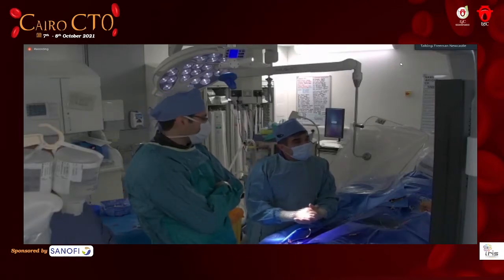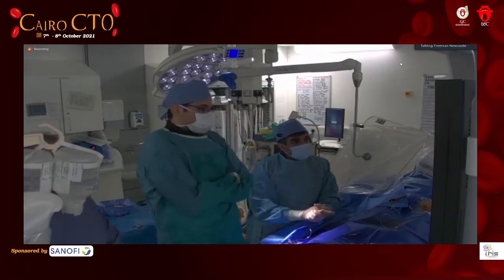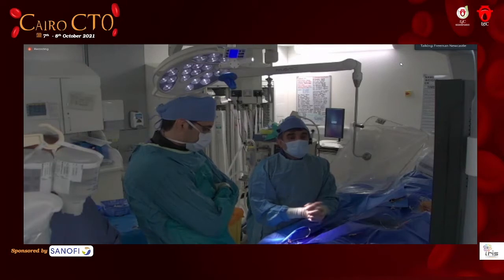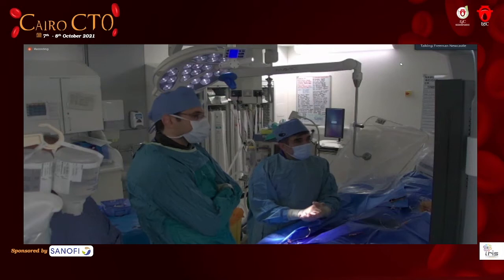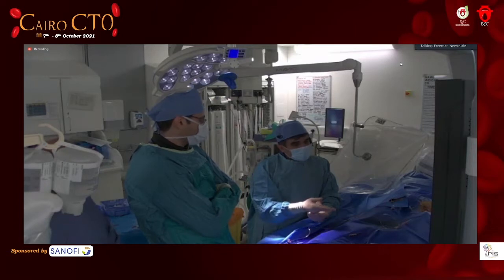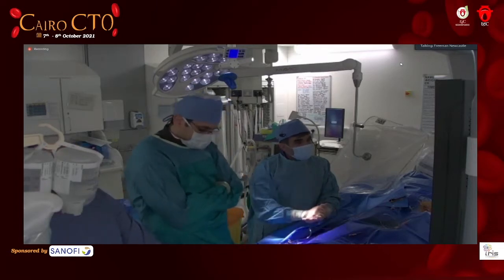Yeah, okay. So because she came here on time and the vein graft was open and it was stented, and it was discussed with me, I said, fine, we'll bring her in so we could open her native artery. Because I know once the vein grafts start going, usually they will go in no time, particularly in diabetics. She ended up with, again, a little bit undersized stent, 2.75 in a vein graft, which I think is a little small, but she had collaterals to the PDA from the OM through the vein graft and also from the LIMA.